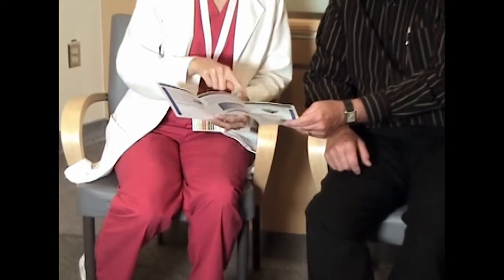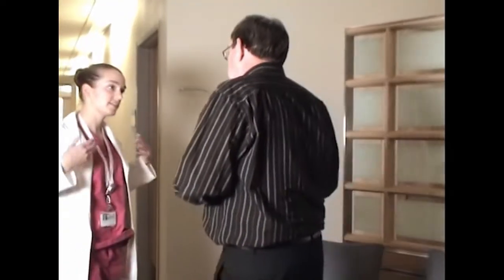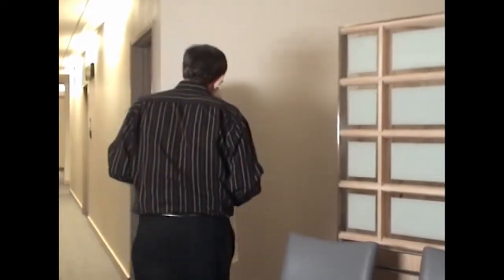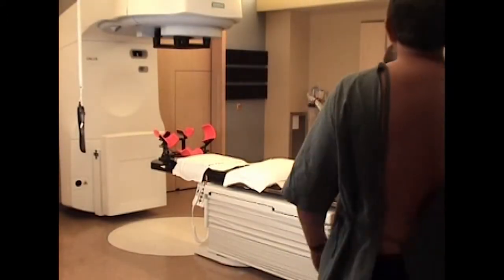On your first day, the therapist will explain what will happen during your treatment. They will review possible side effects with you, referring to the pamphlet you received at your simulation appointment. If you have prepared any questions concerning your treatment, this is a good time to ask them. When you are ready, the radiation therapist will ask you to change into a gown. You may safely leave all of your clothes and valuables in an available locker. You will then be taken into the treatment suite.